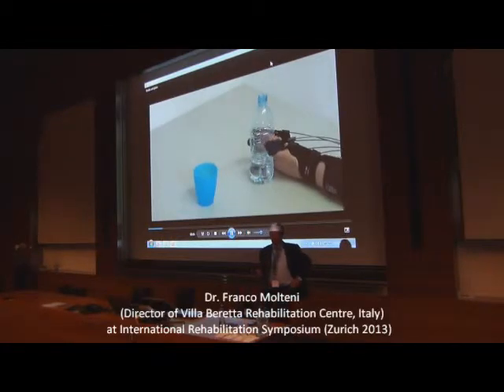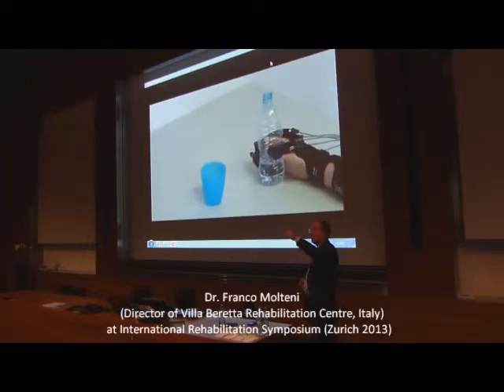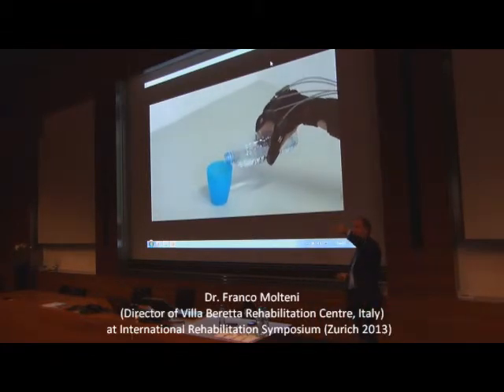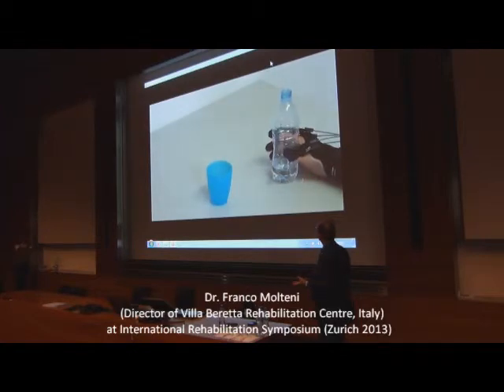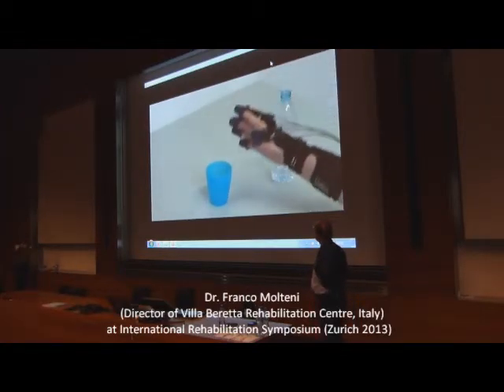That means that we started discussing a system able to move the hand just as a passive movement. But looking at the system in this way, it's okay. It's not the patient's own movement of the hand, but it's not just passive. You have a lot of participation of the patient in this kind of exercise. Then it's very important to change.